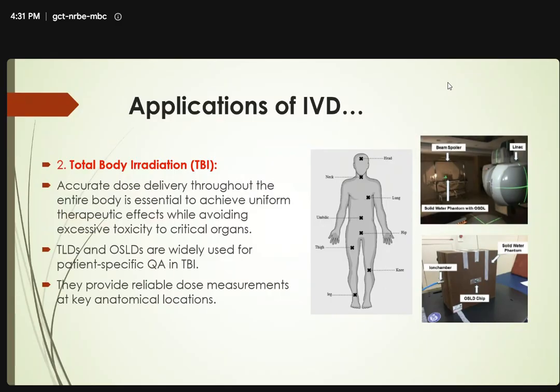newer techniques, like in our institute, we are delivering TBIs in tomotherapy. So this first picture is where we are utilizing this position for TBI QA, and we are placing the OSLDs on different parts of the human body, and we are exposing and receiving the doses. So in TBI, this in vivo dosimetry is very useful.